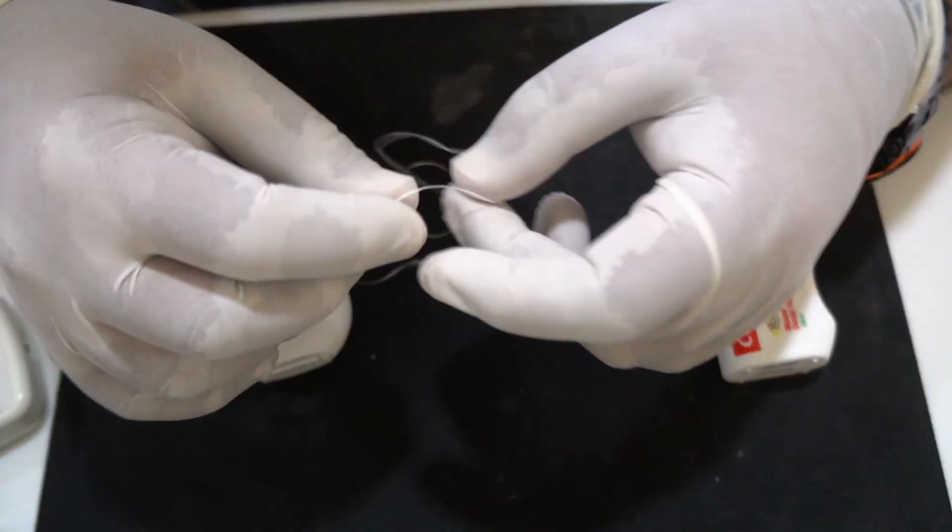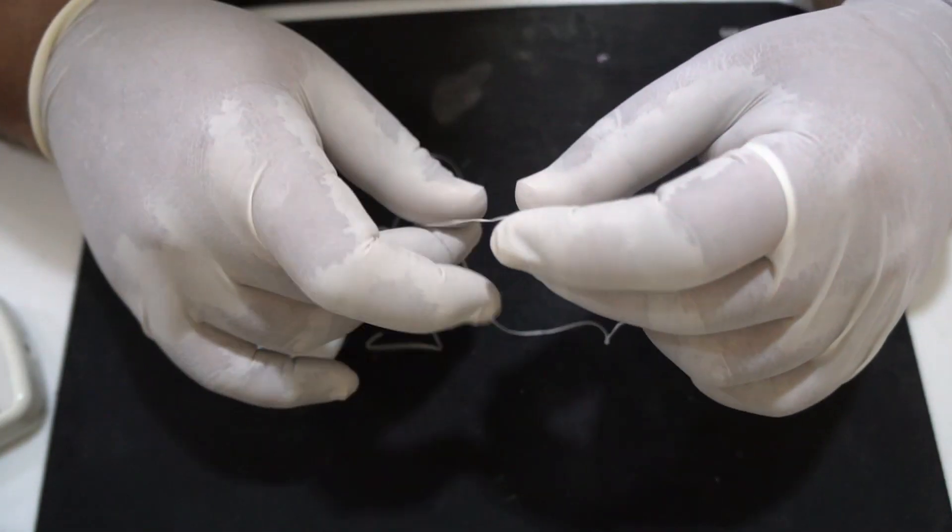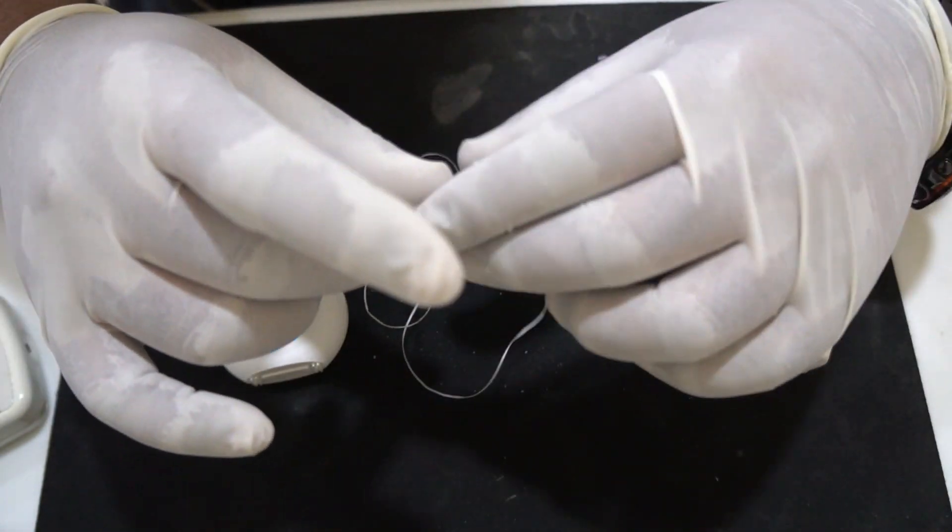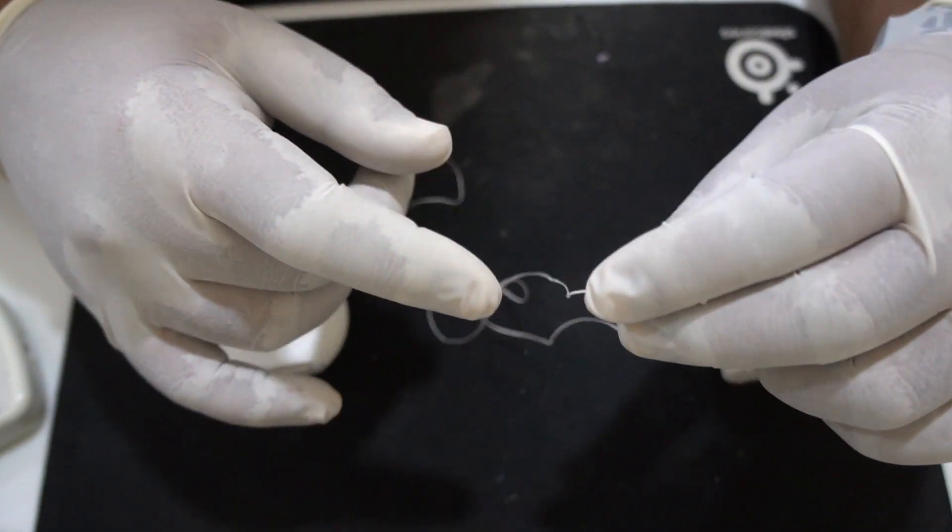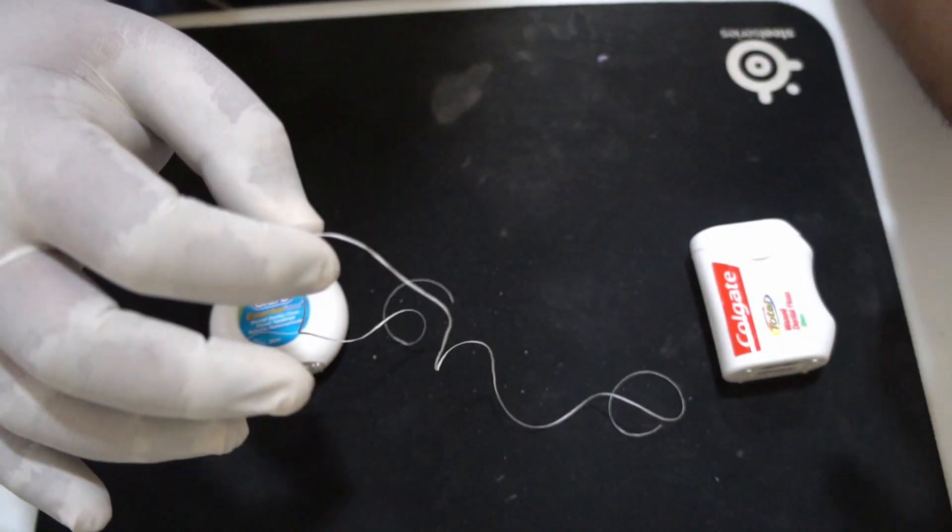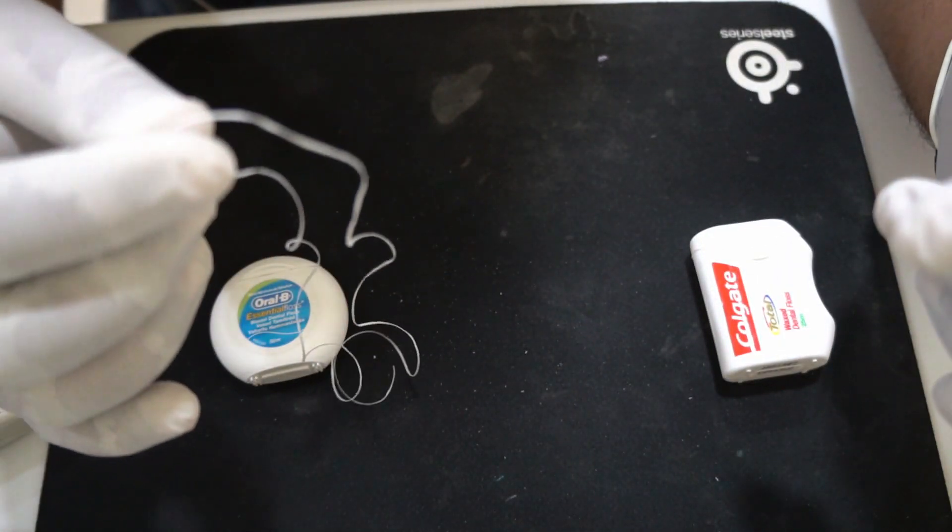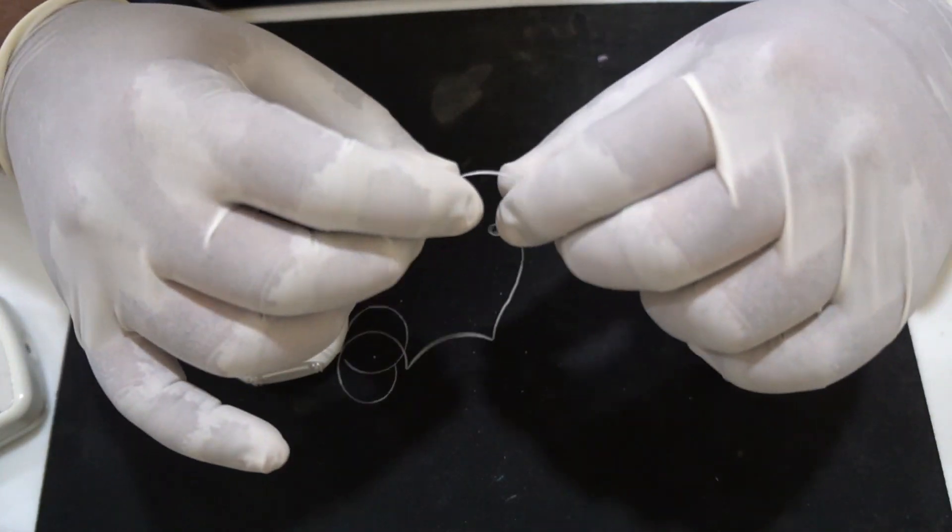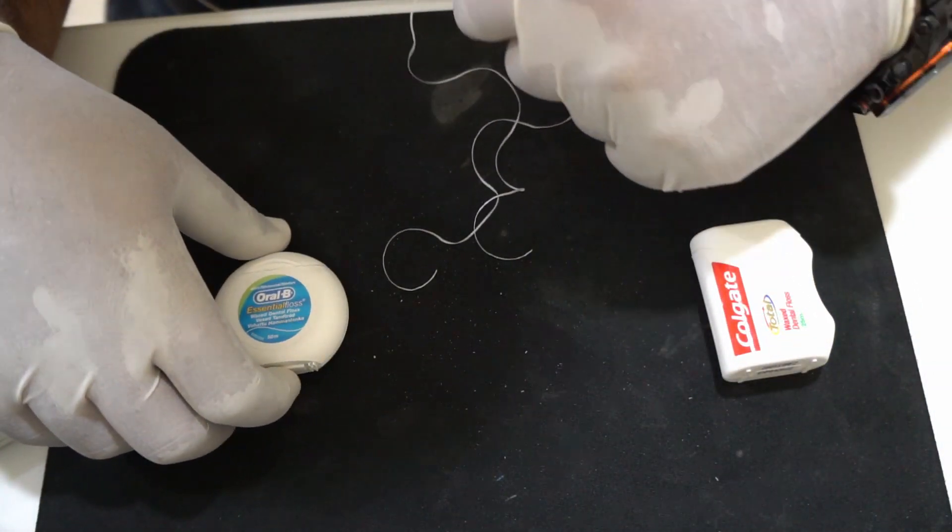Any rubber dam isolation is not complete without creating a watertight seal around the tooth being isolated. The most predictable way of creating such a watertight seal is to use a floss ligature. I have had some requests regarding how to do a simple floss ligature, so I thought I will just give you a demo.